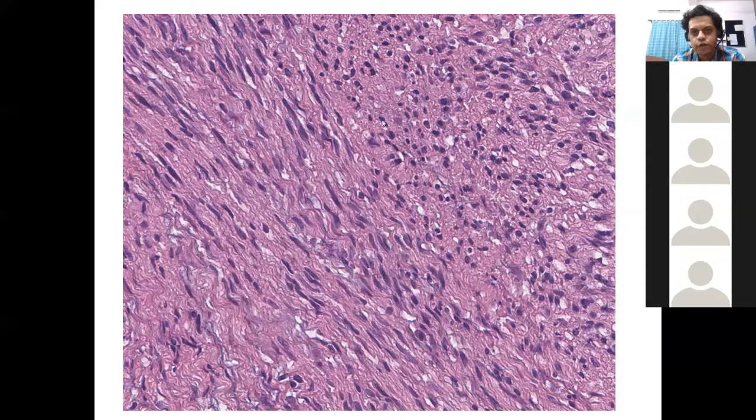Over here, for the juniors, these are basically just nerve fascicles which have been caught in transverse sections, which is why you get them as rounded. So basically don't think of them as another group of cells. These are basically just nerve bundles which have been cut in the other plane.